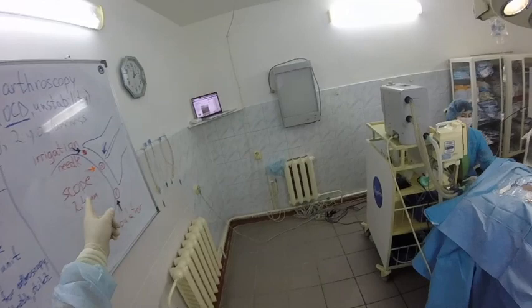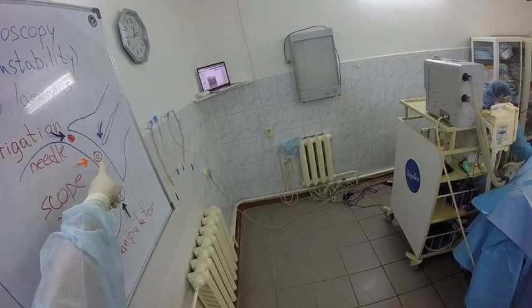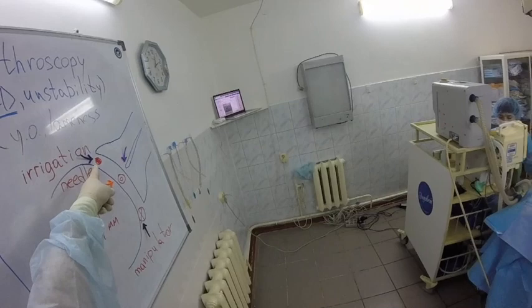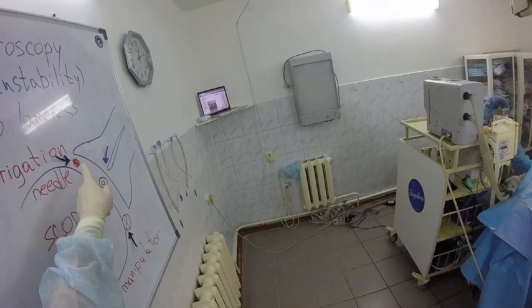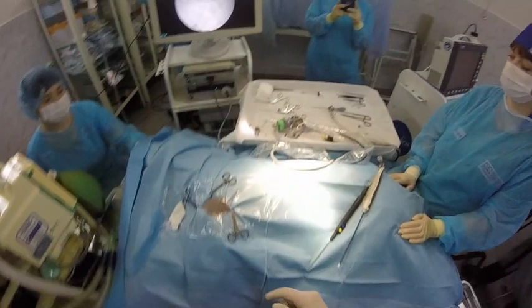For the arthroscopy procedure, we will use one portal near the acromion for the 2.4mm scope, one approach for the irrigation needle — this is the cranial approach — and the caudal approach we will use for the manipulator. Let's perform our arthroscopy procedure.